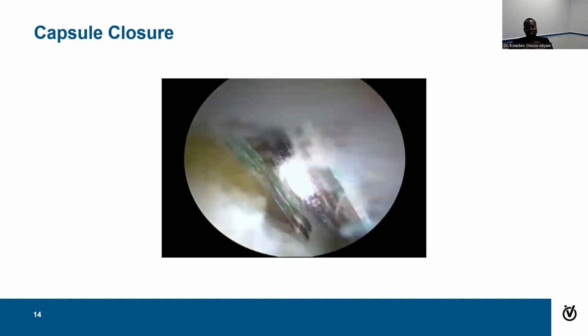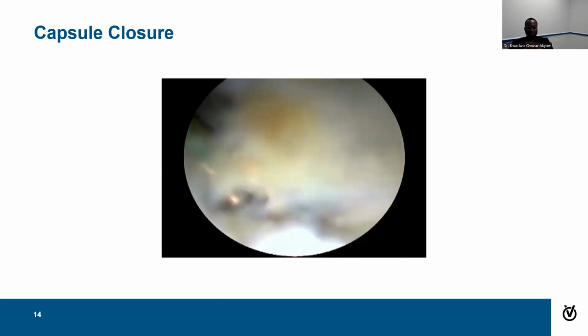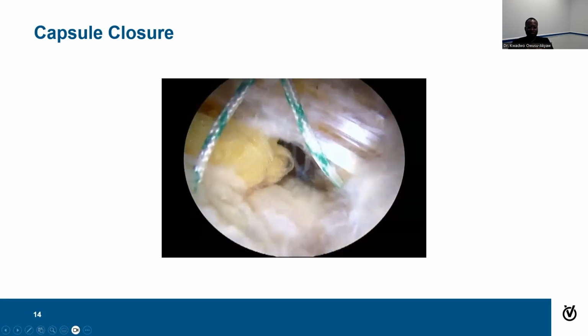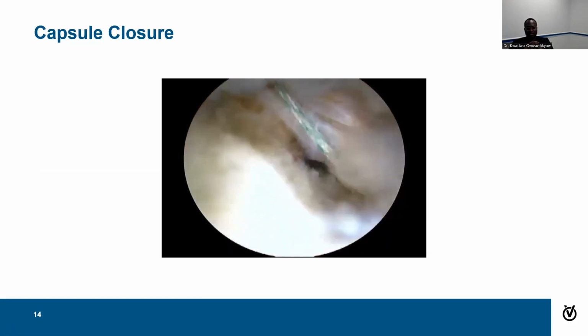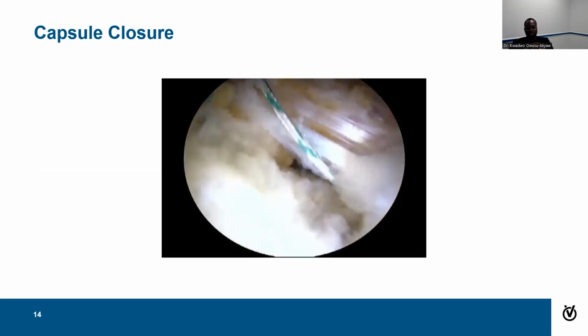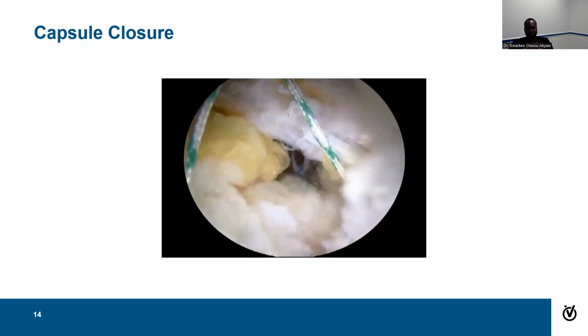Now that's going to hold nice and tight. And just like I'm a Boy Scout, I'm throwing knots in multiple different directions, okay? And each time pushing it down hard with that metal tube. We'll watch it one more time. So that green stitch is on both sides of the cut, all right? And so we put a knot onto there and we let it slide down into the joint. So it should come in here momentarily.